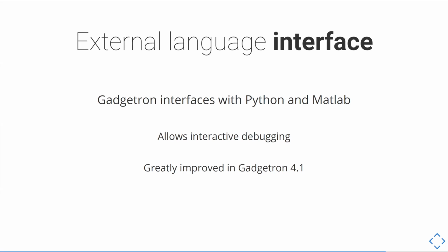Like you can have Gadgetron inside your MATLAB instance and use it interactively like you would with any other data, or you could use it in your IPython notebook.